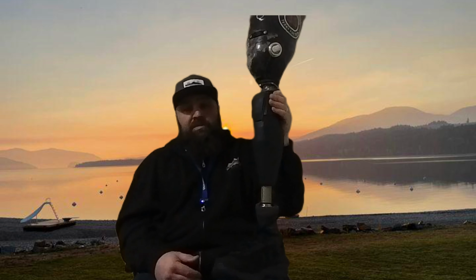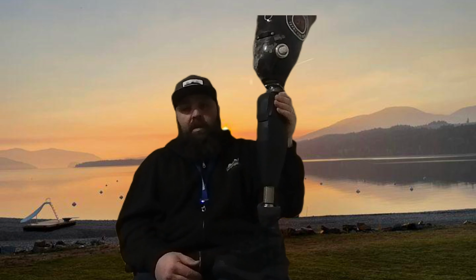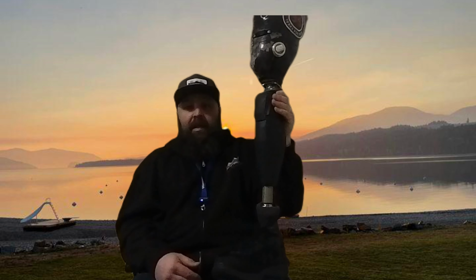Now, if I'm just going to the grocery store, I might take my lighter hydraulic knee, which is a lot cheaper, but it allows me to fall if I have uneven surfaces.